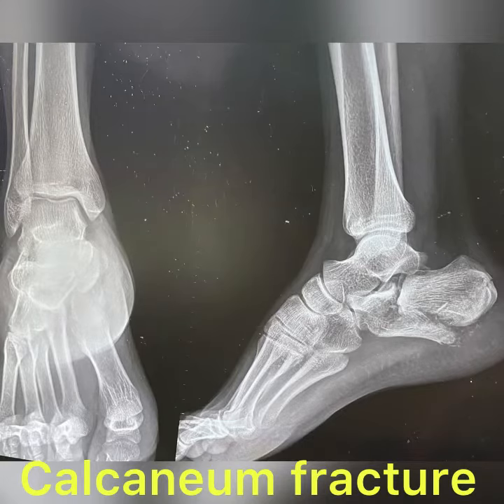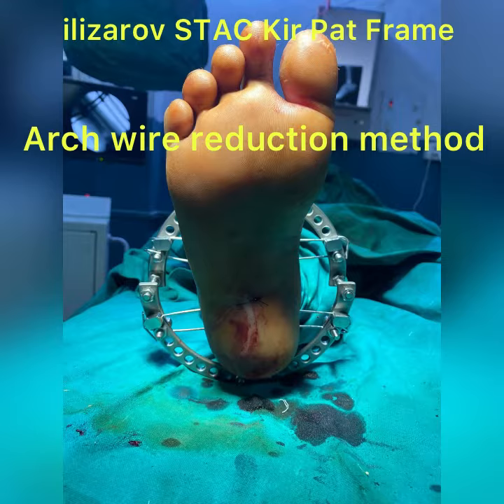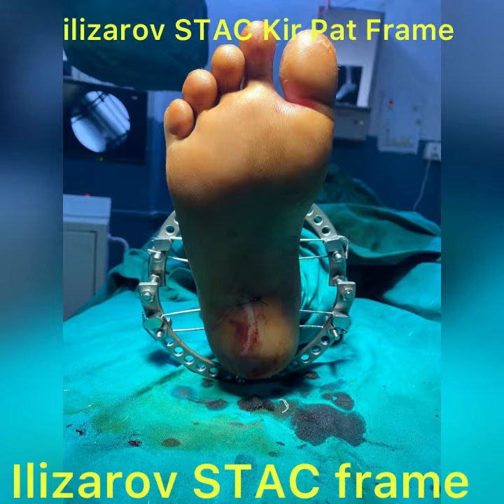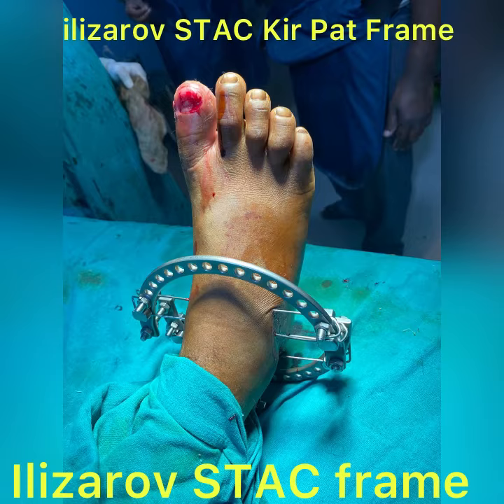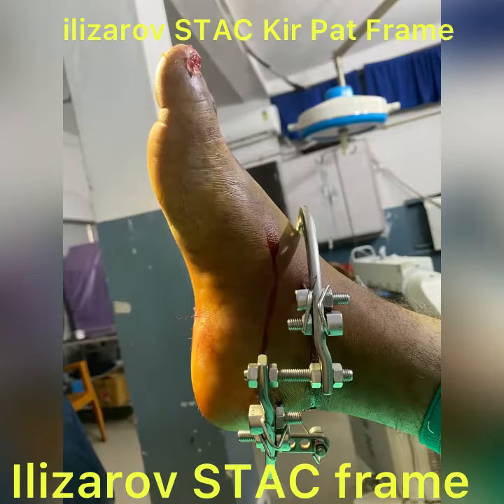This is a case of calcaneal fracture post-traumatic. An Ilizarov external fixator frame was applied. Arch wire technique was used to reduce the fracture fragments. You can see these are the four wires to maintain the arch. It is a dynamic frame, minimally invasive, no blood. The patient can do full movements with this arch frame and this is very comfortable for the patient.